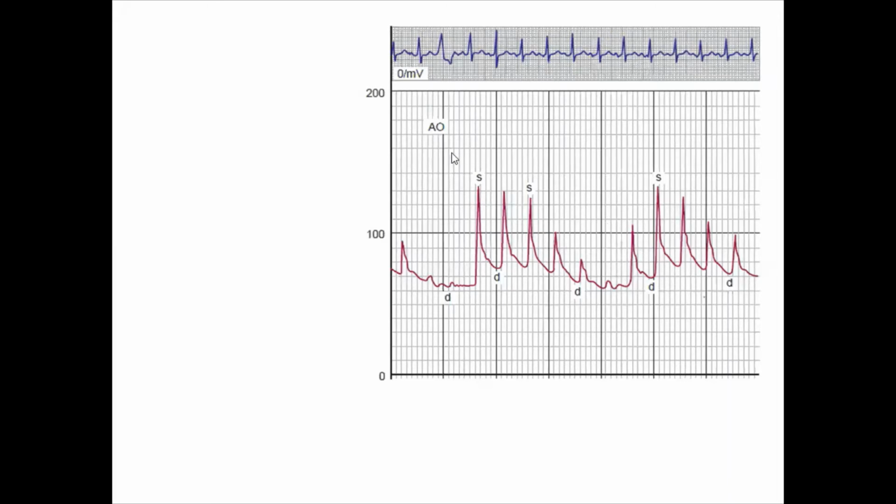Now go back to the aortic pressure. So starting from here, for example, systolic, maybe around 130/80 or 75. Then there is a reduction in the aortic systolic pressure and diastolic pressure until severe reduction in the aortic pressure. So this happened after many beats.